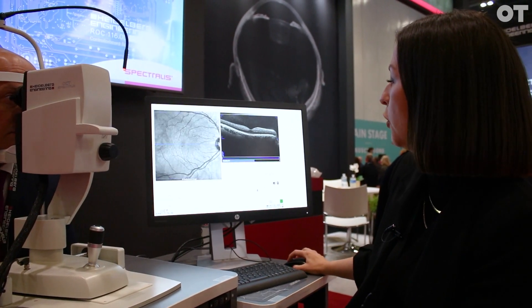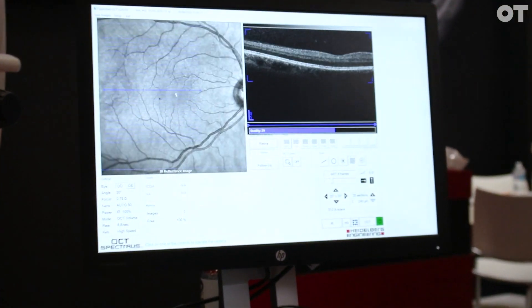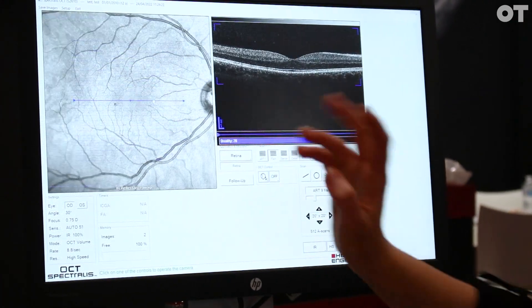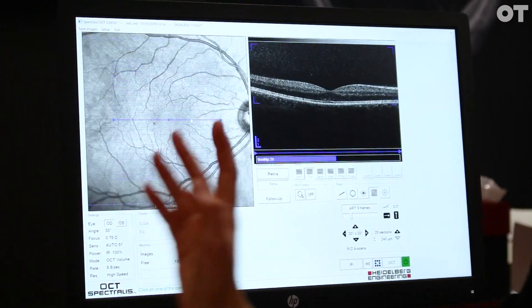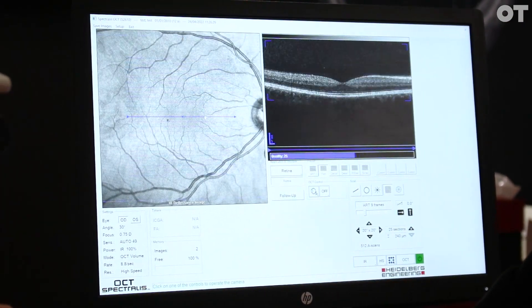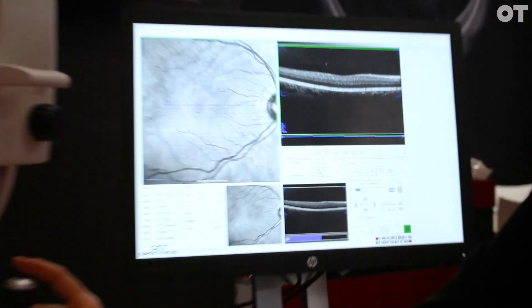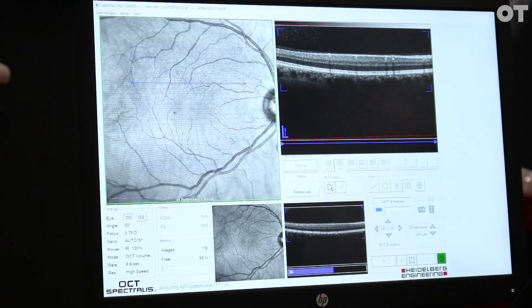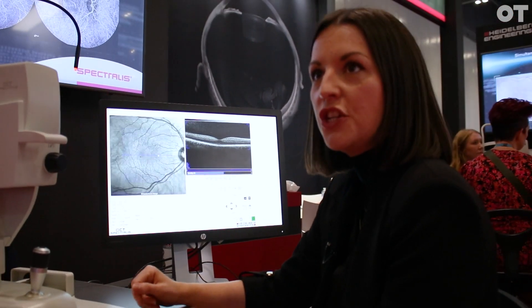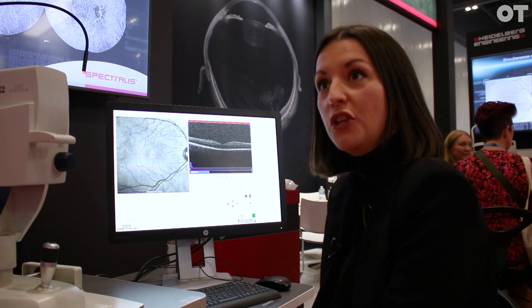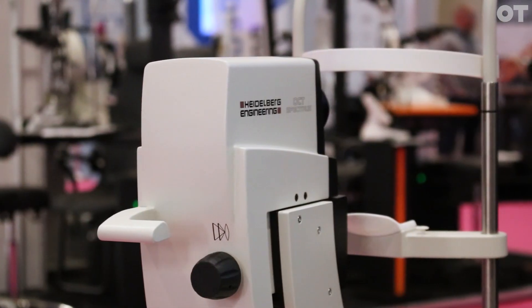It also enables us to do image averaging across a full volume scan — multiple B-scans moving through the retina. I can move this B-scan wherever I want it to go, so you can really move the scans to where the pathology is and scan in high detail. Each B-scan in the volume scan is averaged. Nathan can blink — no problem — it'll pick up and keep scanning from the same location. It's really easy and intuitive to use with everything live on the screen.